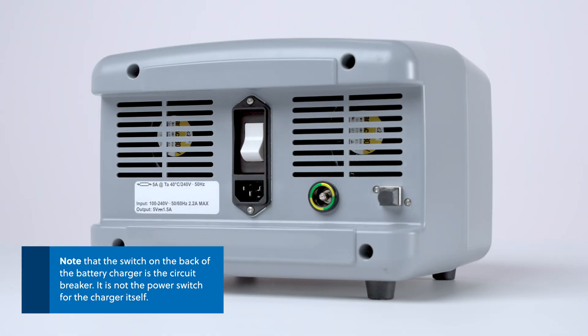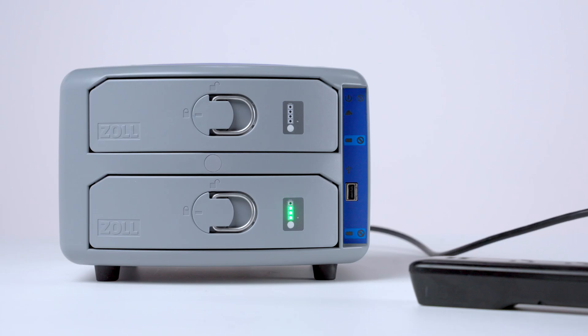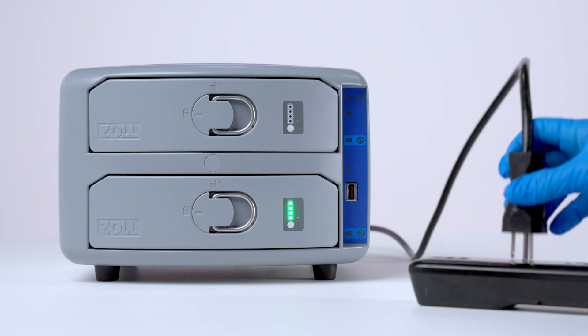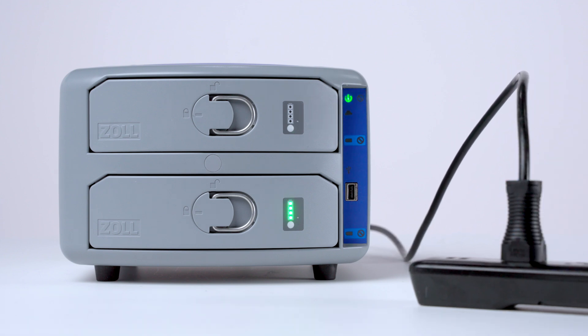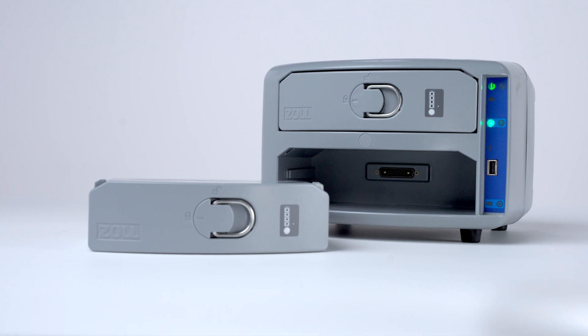Note that the switch on the back of the battery charger is the circuit breaker, not the power switch for the charger itself. To power the battery charger, plug the power cord into a power source. We have now reviewed battery management for the AutoPulse NXT Resuscitation System.